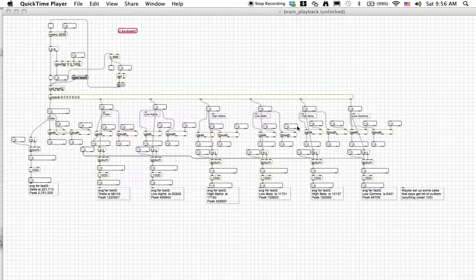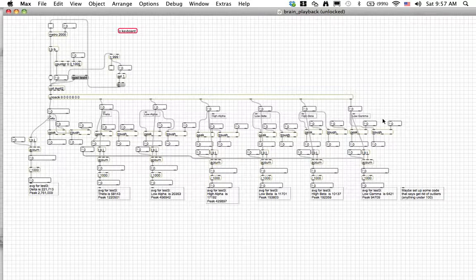Like I was saying in class, the betas are our conscious state. Our alphas, these are things when we start to get relaxed, like the meditation that we were talking about. We start to have activity in these areas. Some of these other ones are only more active when you're dreaming and in deeper sleep. And I forget what the low gamma is. You don't have to worry about that. You can look these up easily online, and I have some material on them on eCampus. But let's focus in on these.